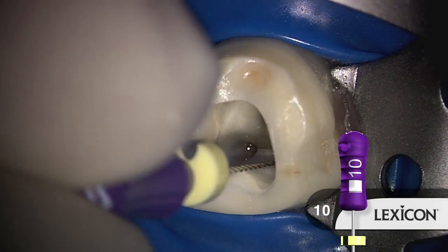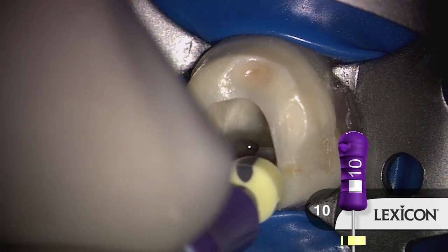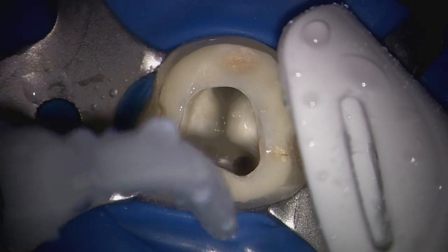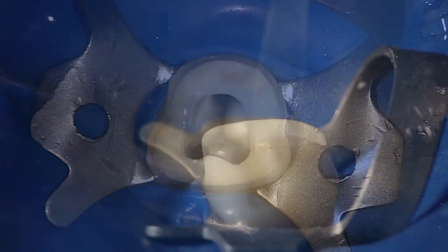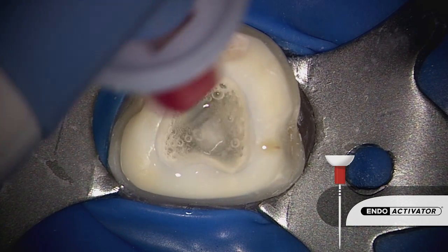It's important to recall that files shape canals, but irrigants clean root canal systems. So, in preparation for three-dimensional disinfection, we can use our favorite final rinse solution in conjunction with the EndoActivator. The EndoActivator serves to exchange solution into the uninstrumentable portions of the root canal space.